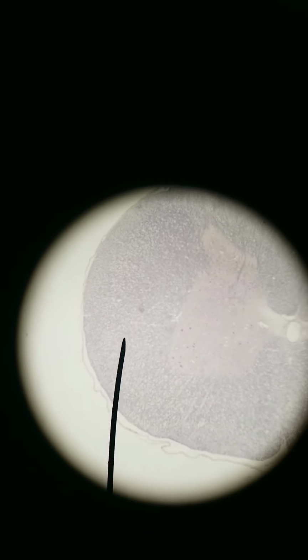The spinal cord has divisions to the white matter and gray matter. For the gray matter, where we find the neuronal cell bodies, since this is the dorsal side, this is the dorsal gray horn, the dorsal horn. Here's the ventral horn, dorsal horn, ventral horn. There is a lateral horn as well, it's just not very visible here, but this is technically lateral where I'm pointing.